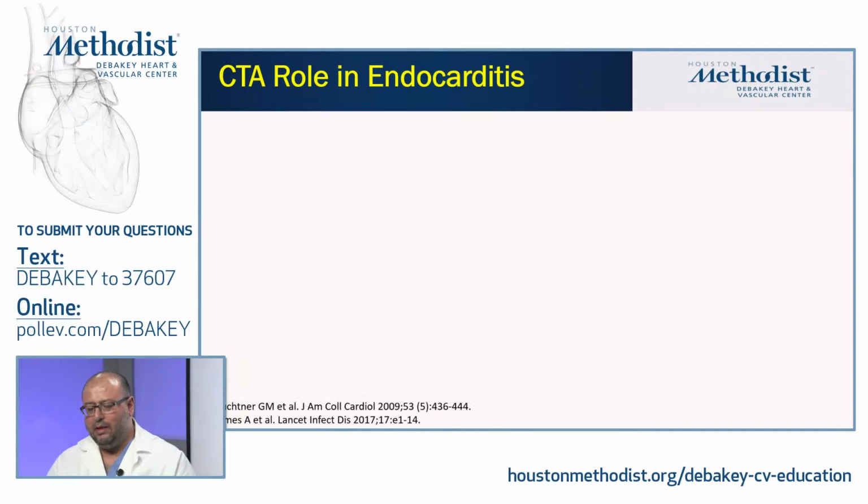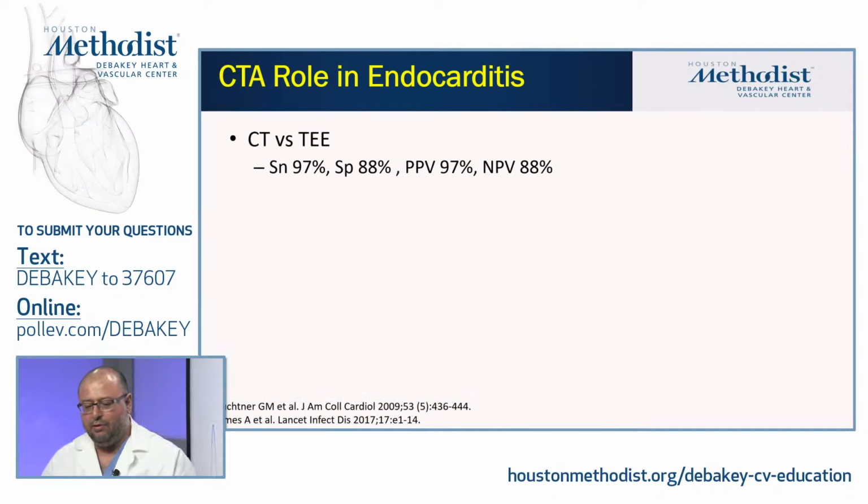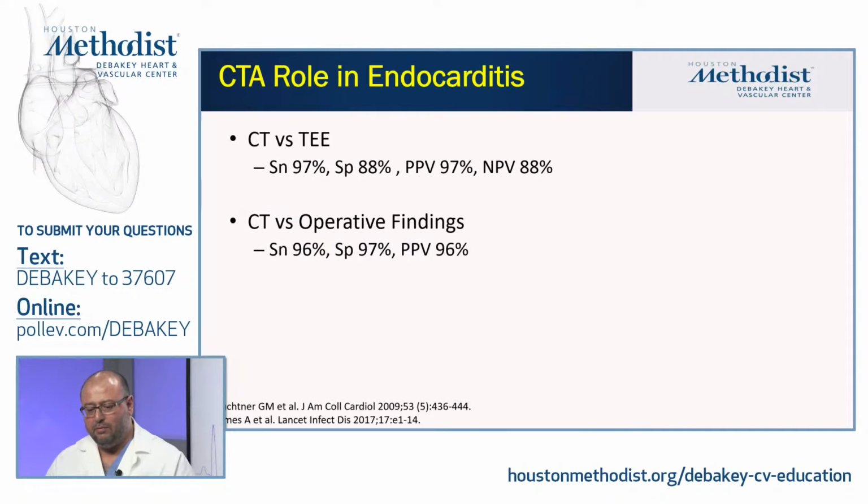So let me give you a rundown initially of how accurate CT is for these assessments. Obviously you have to look at what is your comparator group or gold standard group. So if you're going to use TEE, CT is pretty good for assessment of endocarditis, sensitivity is 97%, specificity is 88%, and its negative predictive value is 88%, and this is mainly because small, highly mobile structures may not be well seen by CT. It depends on the temporal resolution of the system. If we're going to use operative findings, then sensitivity is pretty high, 96%.